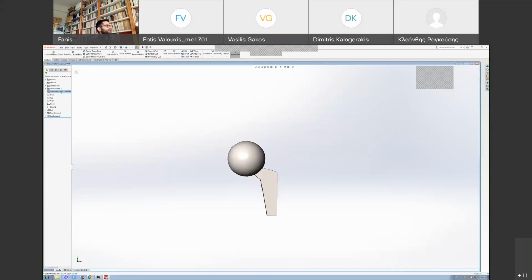For this particular, I did assign it a material. It's titanium alloy. I will tell you what material to assign it in your assignment. It's okay. So go to SolidWorks add-in. We're going to be using SolidWorks simulation, which also usually takes a decent amount to load. So hopefully it will be okay.